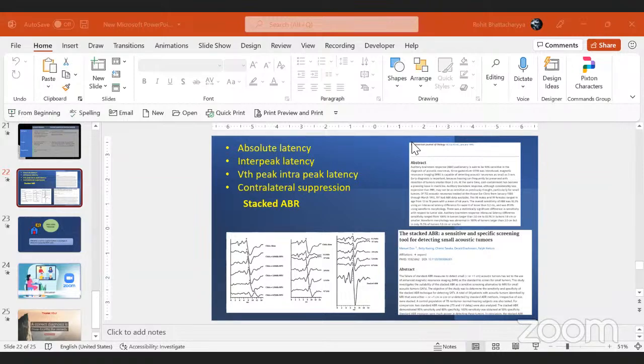As we have seen in one case, the semicircular canal dehiscence case, there it could be a rising pattern, which is not a conductive hearing loss. Actually, it is an involvement of the inner ear. Then another case is Meniere's disease, where most commonly at the initial stage we will see a rising pattern of audiogram, and it is, of course, a sensorineural hearing loss case.